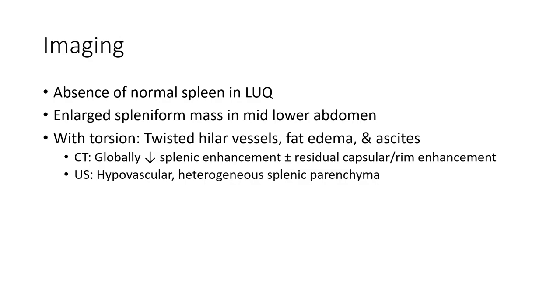Imaging can show absence of the normal spleen in the left upper quadrant and a large splenic-form mass in the mid to lower abdomen. With torsion, there is twisting of the large vascular pedicle and ascites. On CT, there is globally decreased splenic enhancement with possible residual capsular ring enhancement. On ultrasound, a hypovascular heterogeneous splenic parenchyma is seen in cases of wandering spleen with torsion.